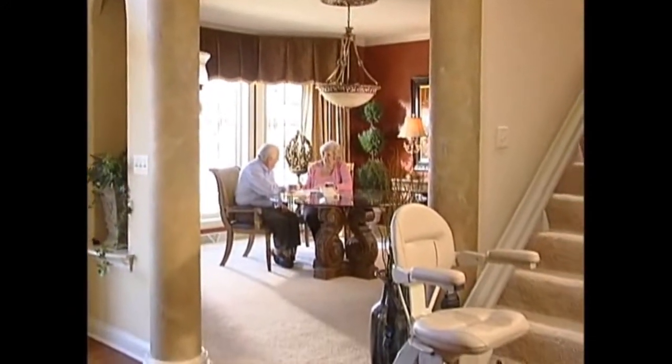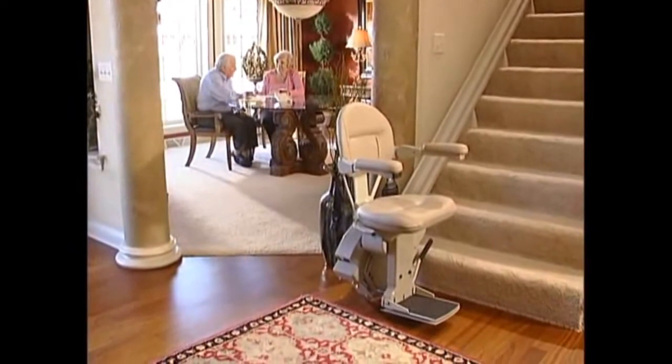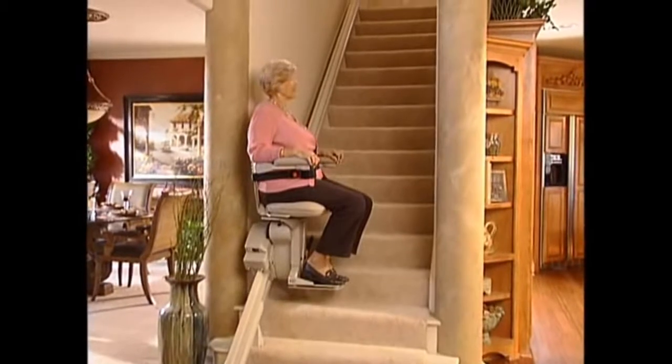There you have it — the top of the line, the standard against which all straight rail stair lifts will be measured. The ElectraRide Elite: near perfection in motion, the essence of form and function.